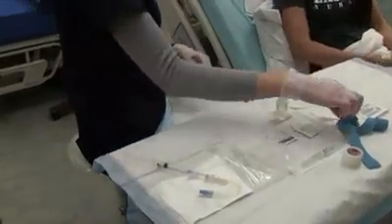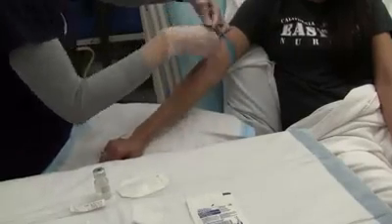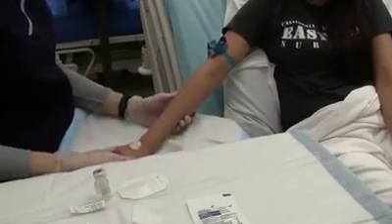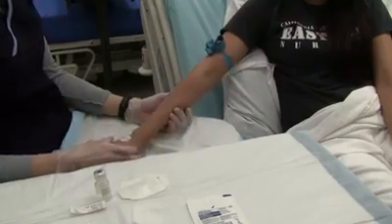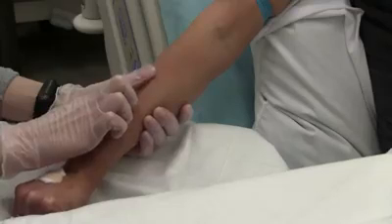Dilate the patient's vein. Place the extremity in a dependent position. Apply the tourniquet firmly 6 to 8 inches above the venipuncture site. Explain to the patient that the tourniquet may feel tight. Encourage the patient to clench and unclench his or her fist. You may lightly tap the vein with your fingertips.